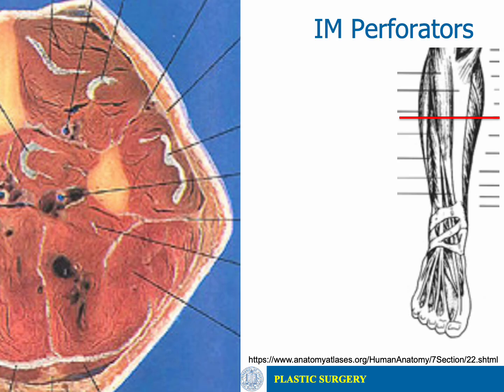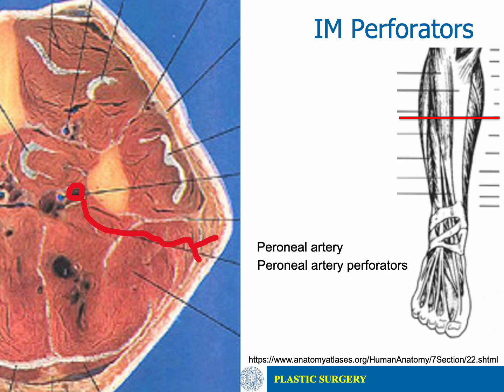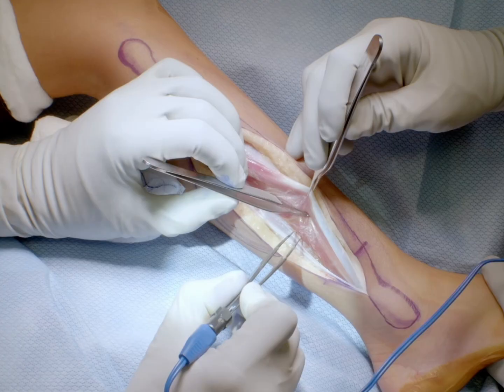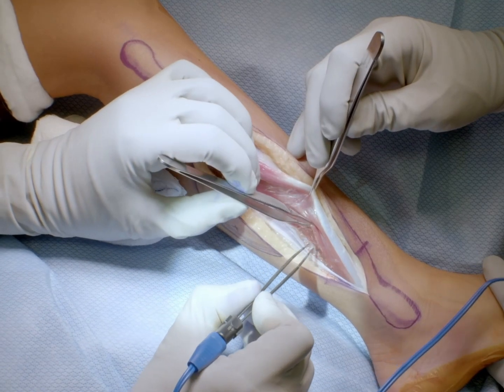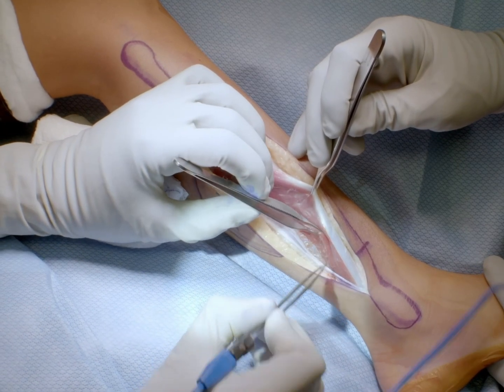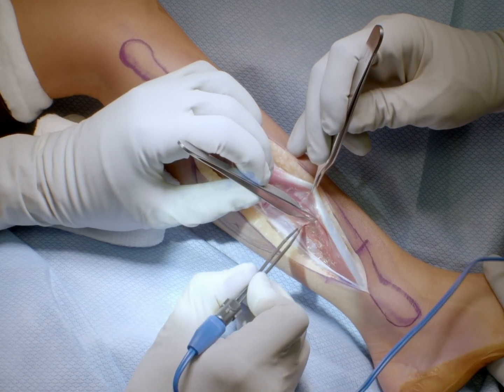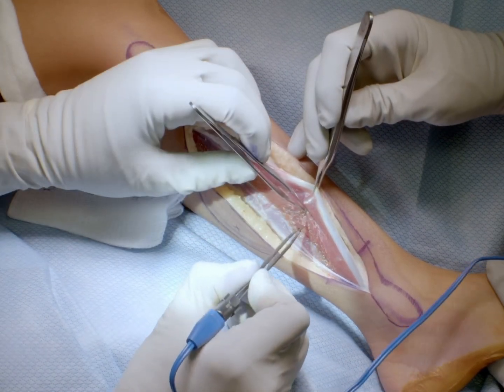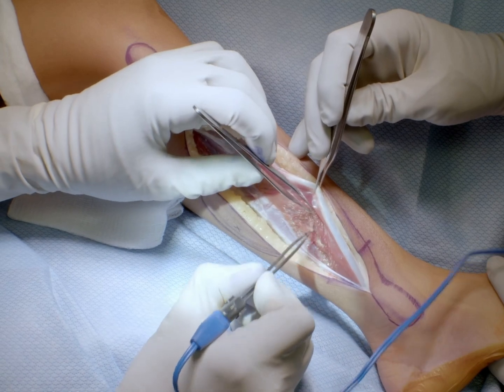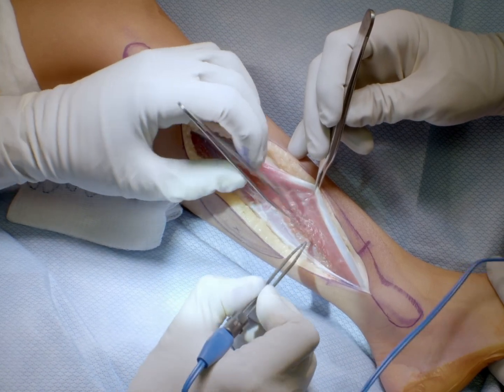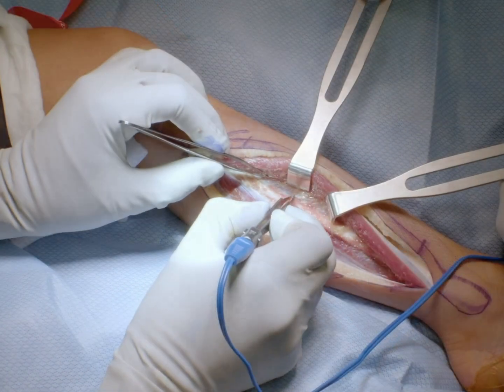If no perforators are seen at the septum, they may instead course intramuscularly through the FHL and soleus muscle, and will be identified at the posterior incision. Continuing anteriorly, we proceed with electrocautery, leaving a one to two millimeter cuff of the peroneus longus and brevis on the bone to strictly avoid injuring the periosteum. The goal is to reach the intramuscular septum between the lateral and the anterior compartment.